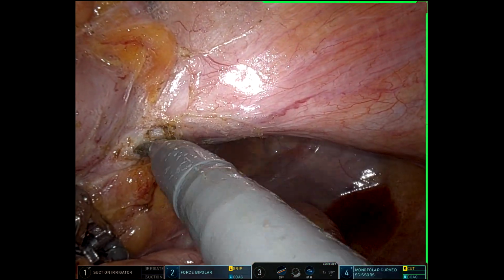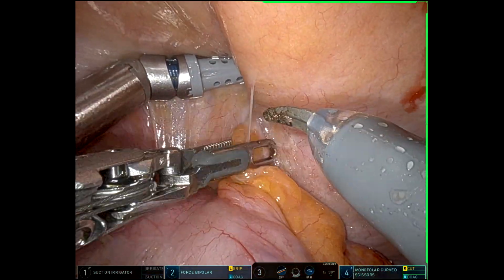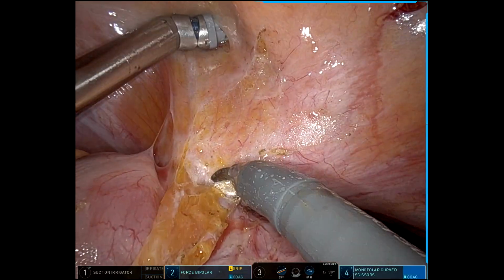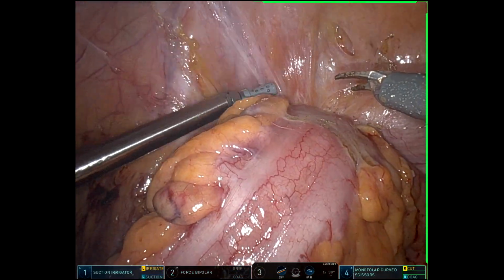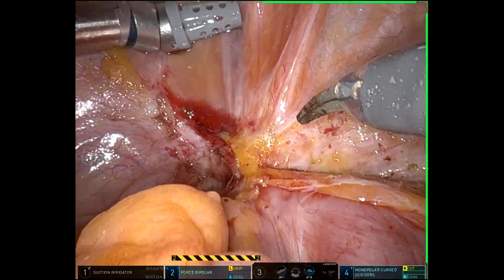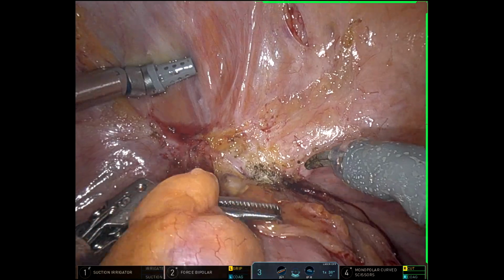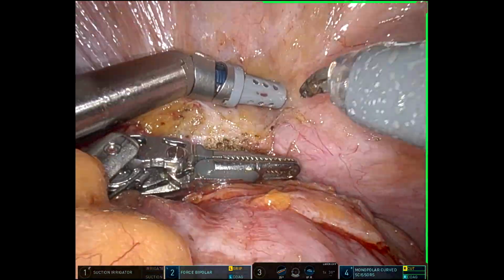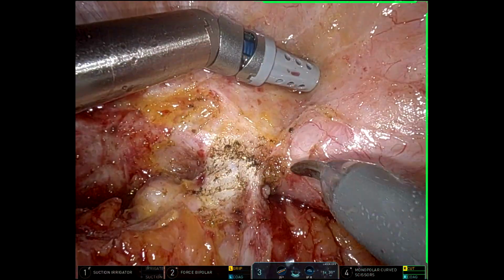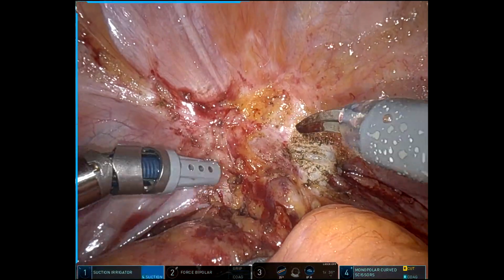You can see ICG leaking from that area, so you know that that is definitively the fistula, from the ICG that was placed into the catheters and is now leaking with the urine. And just slowly coming down and around this, I'm trying to get the fistula to come to a point, because I certainly don't want to inadvertently be dissecting around inflammatory rind thinking it's the fistula and get too close to the ureter or some other critical structure.